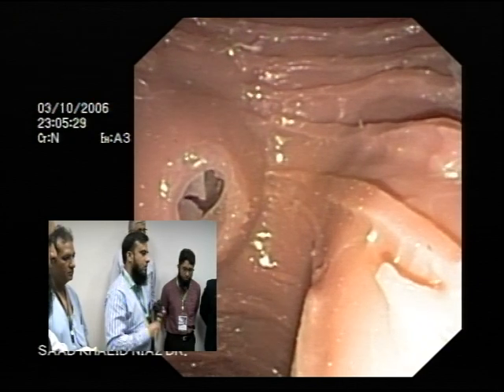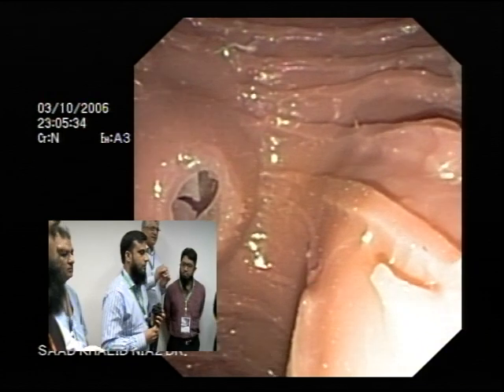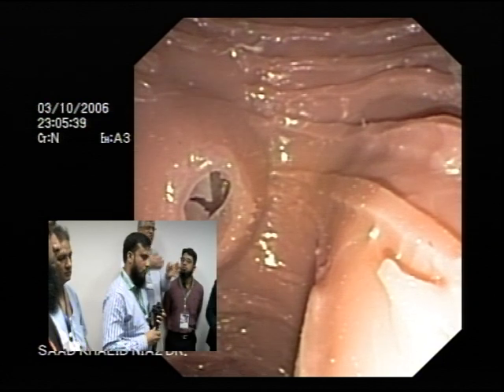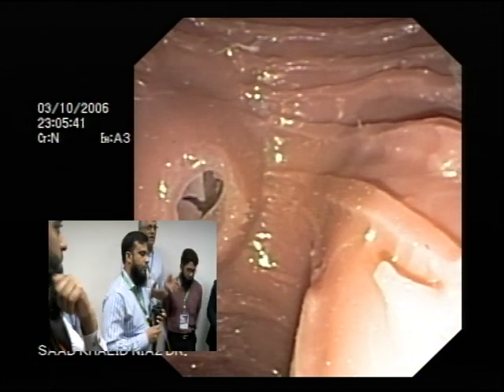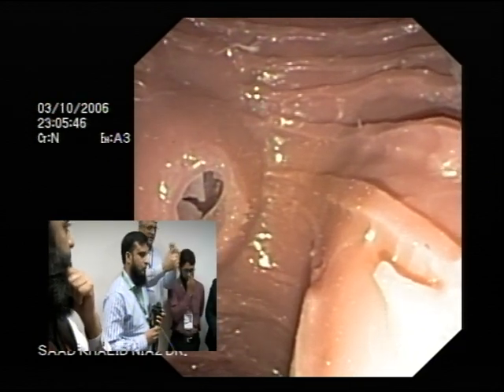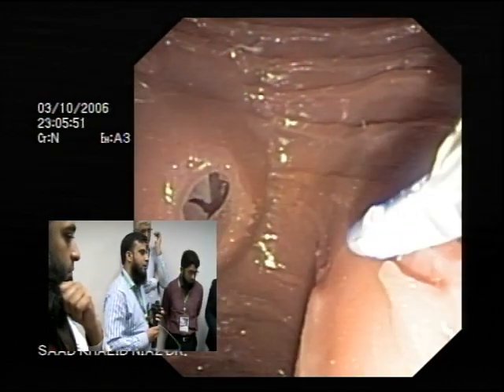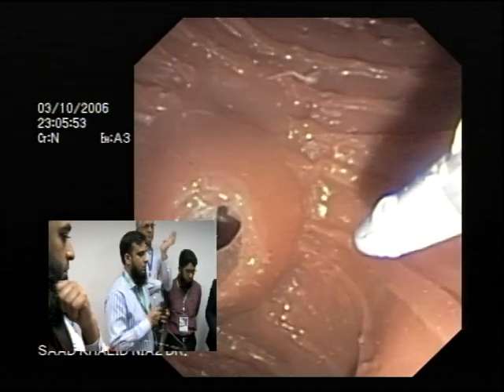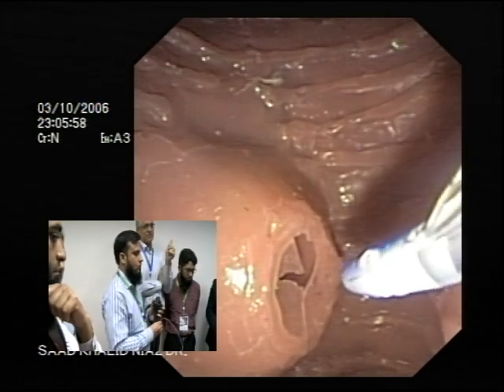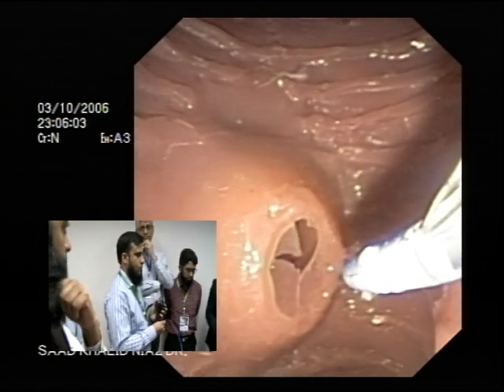Okay, that's an important thing he's mentioned. When you are inserting anything, lock the elevator. Otherwise, well, it makes no difference. What happens is you'll keep going in and you won't know. So you lock the elevator, and when it knocks, you let the elevator go, you know it'll come out. Elevator up, you'll see it. Before starting the procedure, you must make sure that your right, left, up and down, and your elevator are functioning. There is no point doing an ERCP if any of those are not.